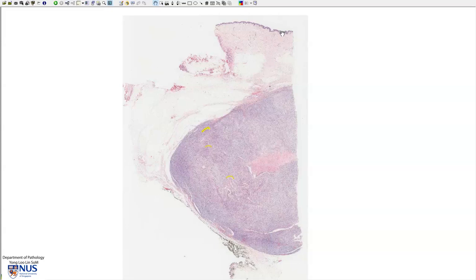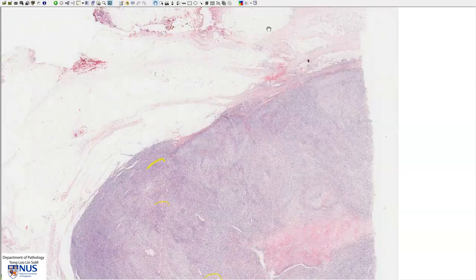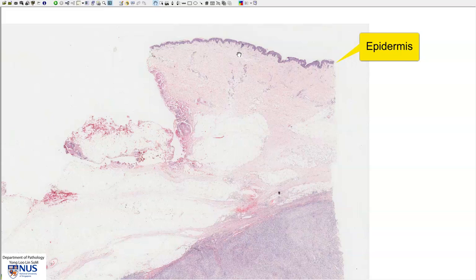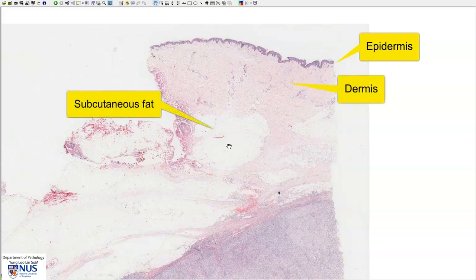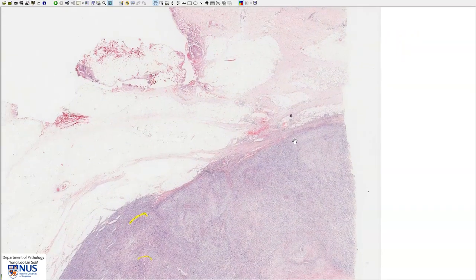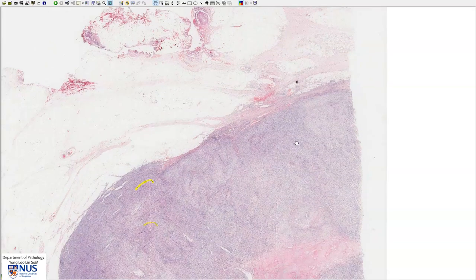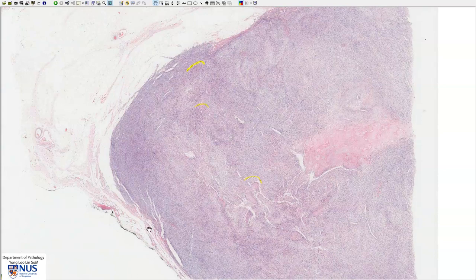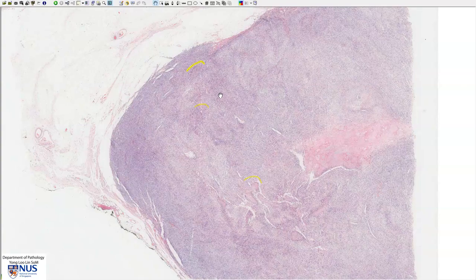In this slide we can see the skin here — this is the epidermis, then the dermis and the subcutaneous fat. Quite deep down we can see that there is a relatively well demarcated tumor mass, and leiomyosarcomas are frequently quite well demarcated even though they are malignant.